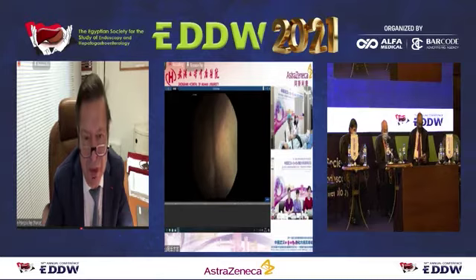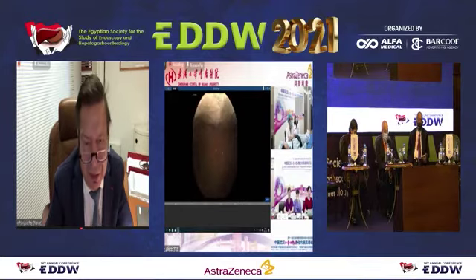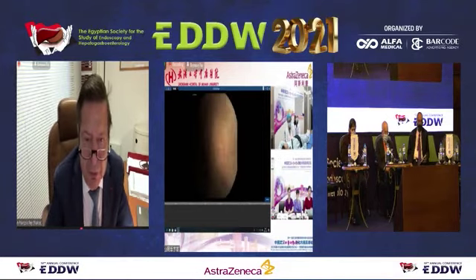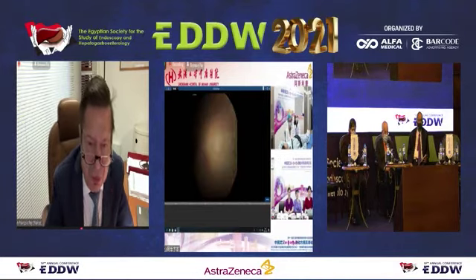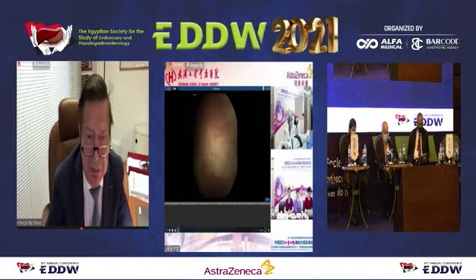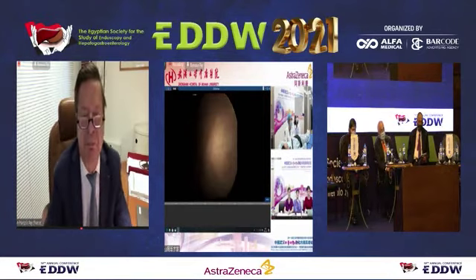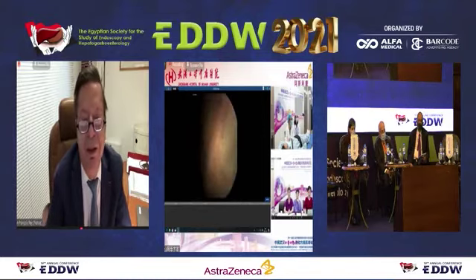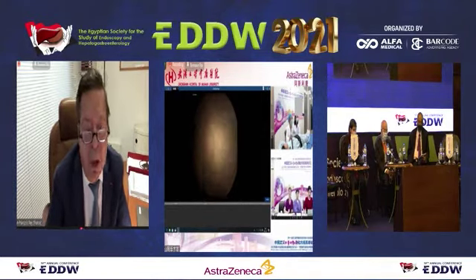Thank you. And this guided capsule is very popular in China. More than 200 hospitals are using the gastric guided capsule, especially because China has a huge population and the number of gastroenterologists is not so high compared to the population. So that means that this kind of examination could be carried out by a technician.